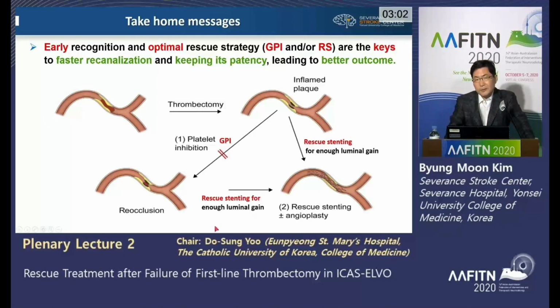Also, if reocclusion does not respond to GPI infusion, or reocclusion occurred after GPI infusion, rescue stenting for enough luminal gain also may be helpful.